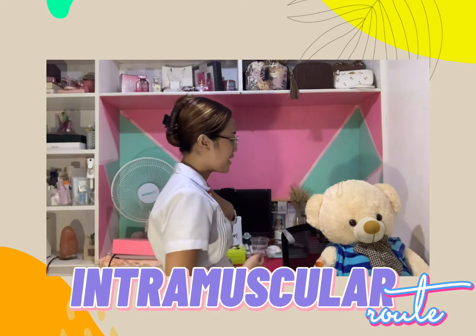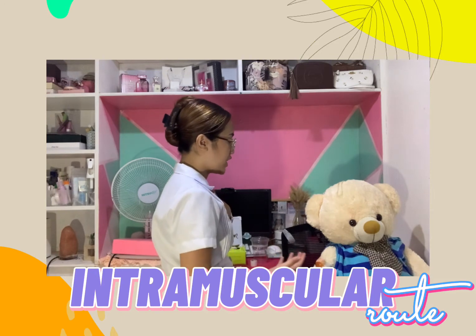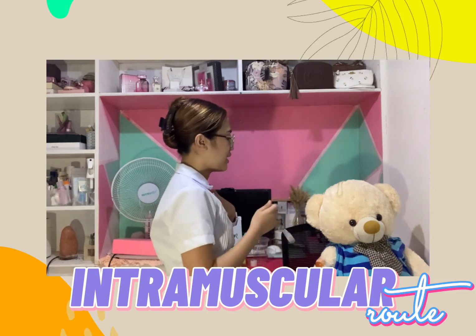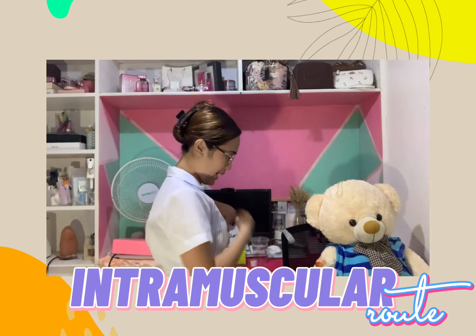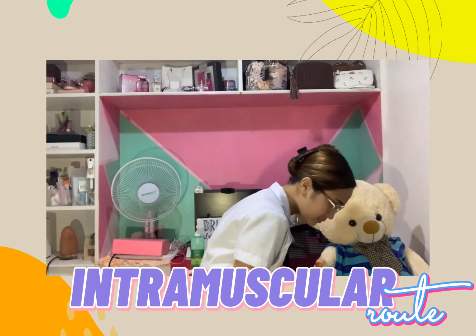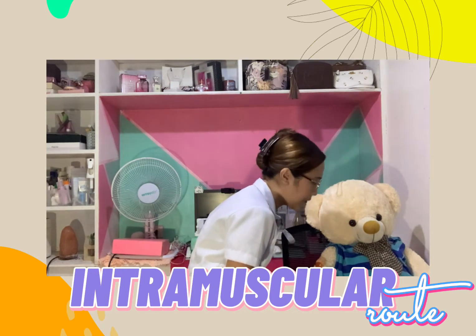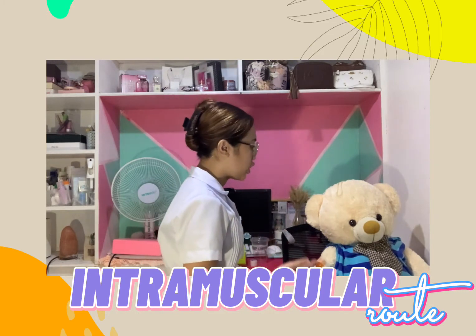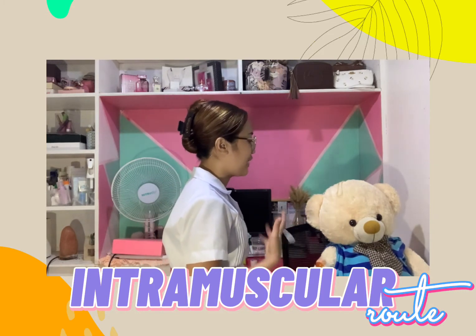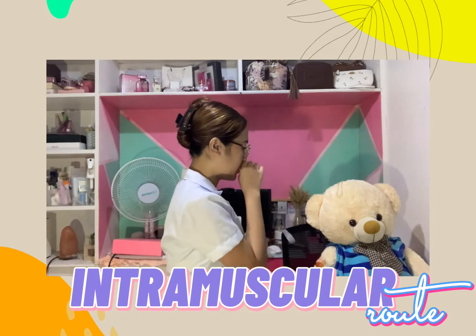Good day ma'am, I am Nurse Curie and I will be the one who will administer the medication on you using the intramuscular route. To verify your identity, ma'am, again, can I ask for your name? Also ma'am, can I ask for your birth date? Okay. Ma'am, I am going to administer influenza vaccine, also known as the flu vaccine, on your deltoid area using the intramuscular route.